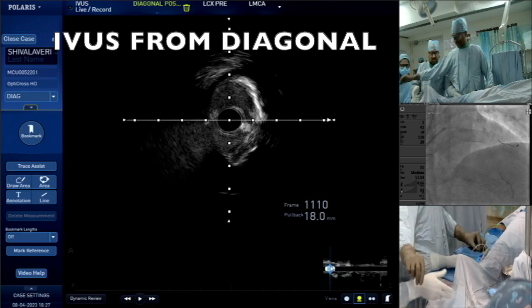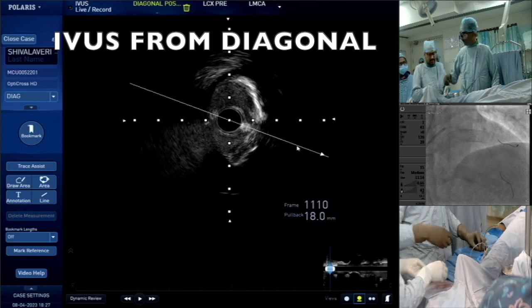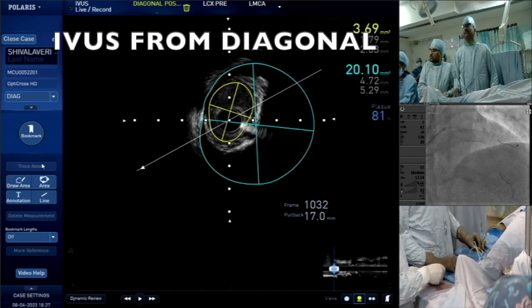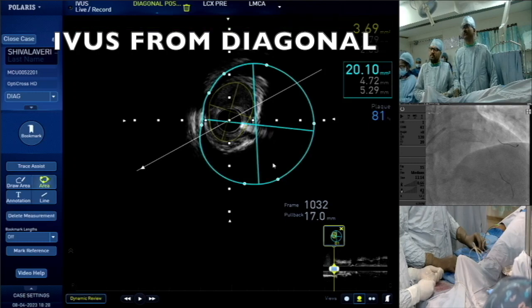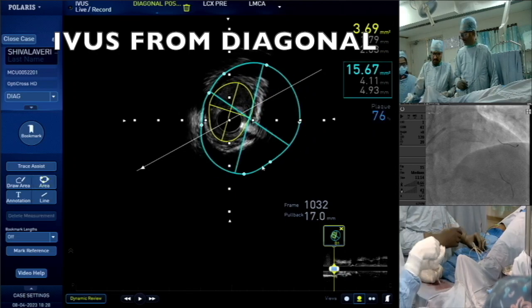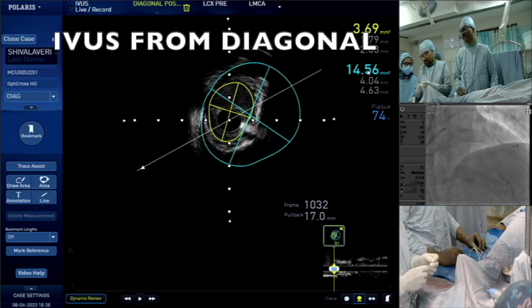We already did enough on the LAD side, so give me a Flextome, please, for the proximal LAD. 315, sir. What is the size of the ostial LAD? Ostial diagonal, please. We are at the diagonal, sir. At the ostial diagonal, we are getting a lumen area of 3.6.